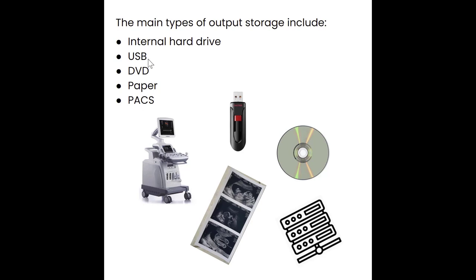Our other options do include a USB, which can be plugged in directly to the machine. You can export your pictures onto the USB, or you can export pictures onto a DVD. Now, most computers these days don't have DVD drives, so USB is becoming a little more popular. But you need to be careful about how you export your images with USB or DVD. Again, we're going to talk about PACS and DICOM images. DICOM images are very specific to the PACS server, and most computers cannot view those images. So make sure that you are exporting your images in JPEG format so that they can be opened on your basic personal computer.